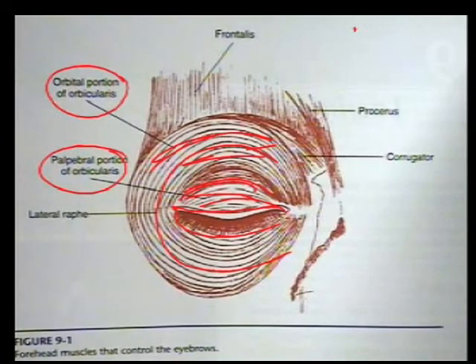And if you attempt to insert the lens when they're in this little blepharospasm, good luck. Probably not going to happen. The best way, and I'll show you this this weekend, is to securely grip the lids so you can position them, but have a feel for whether the patient is relaxed or the muscles have tightened up. And with proper instruction, the patient will relax and you'll be able to open the lids and place the lens on the eye. But don't try and overcome the power of the orbicularis if they have gone into this spasm.